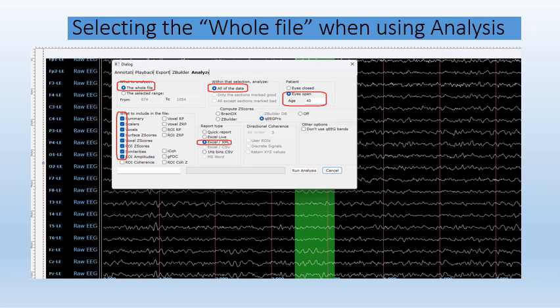So this whole process of automatic editing saves a great deal of time, and it can produce a more accurate editing than you can manually.